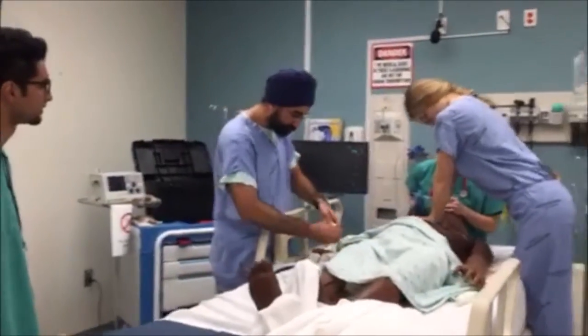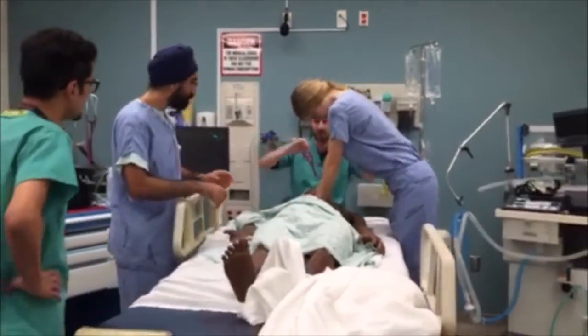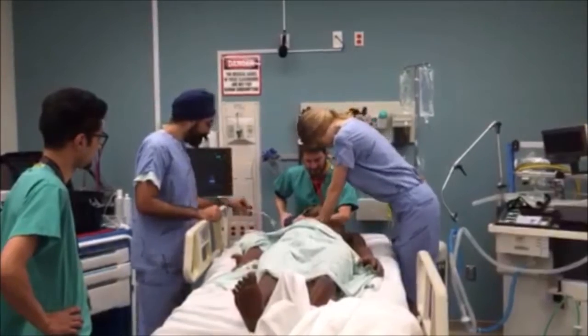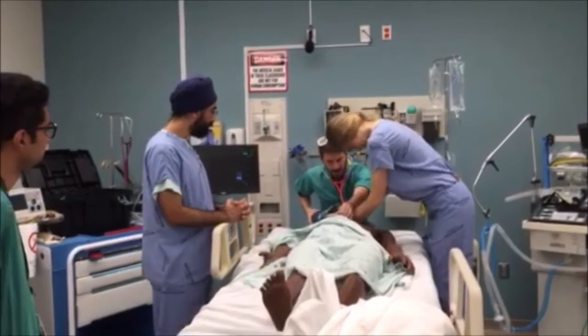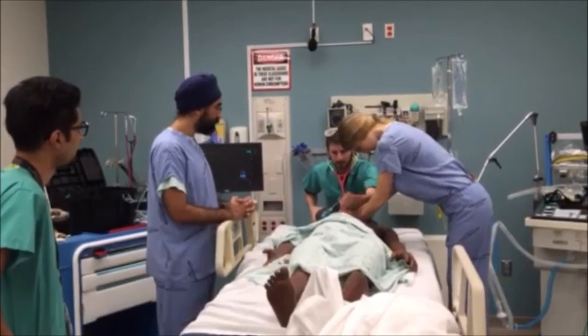All right, I have a 7.5 tube. It's 23 at the lips. Let me take a listen, see if I can hear breath sounds. It's kind of hard to hear it on the left. Mm-hmm. Also a little bit hard to hear it on the right. I think I hear something in the stomach, but it's actually really hard to tell. I'm not sure if we're in or not.